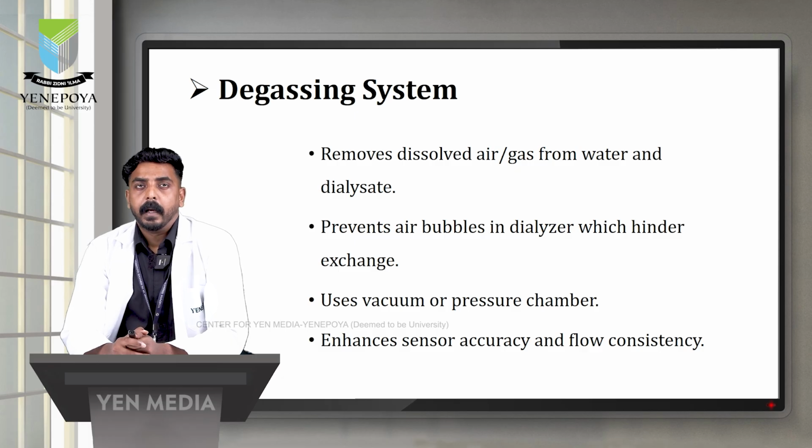Degassing system. This system removes dissolved air or gas from the water and dialysate. It also prevents air bubbles in the dialyzer which hinder exchange. The system uses a vacuum or pressure chamber and it enhances sensor accuracy and flow consistency.